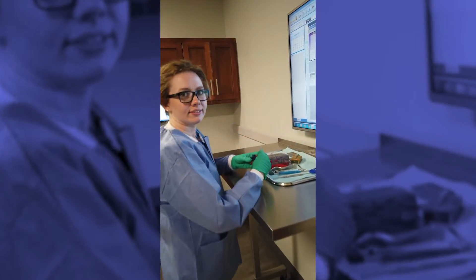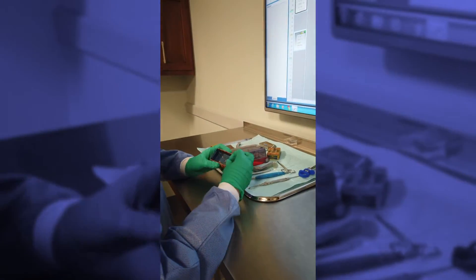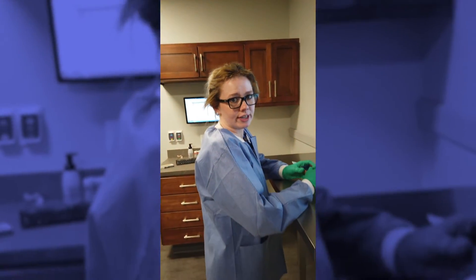Hey Ashley! Hey! Technically speaking, what are we gonna be looking at today? We are gonna be looking at how to make a temporary crown for an implant.